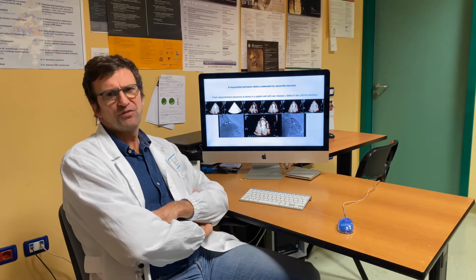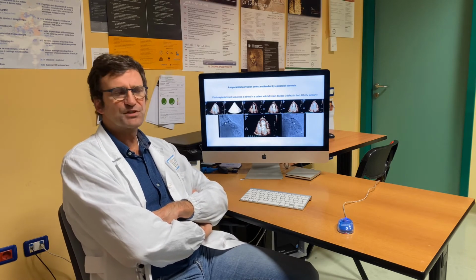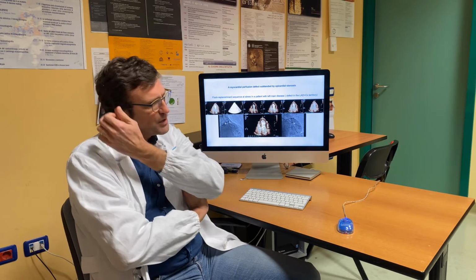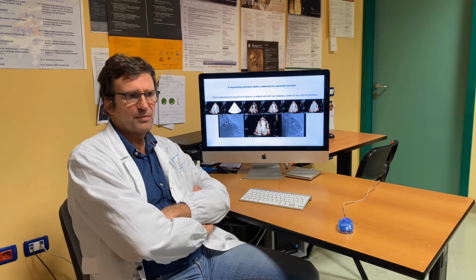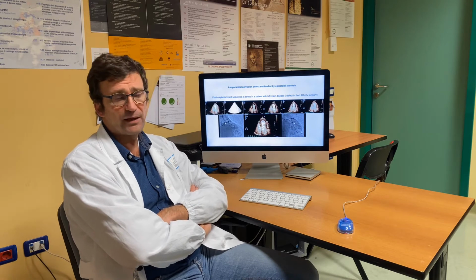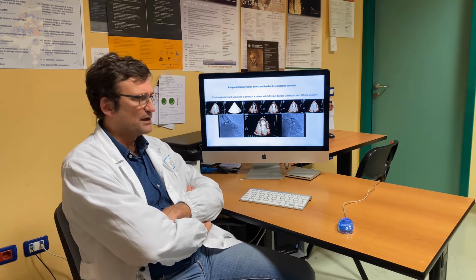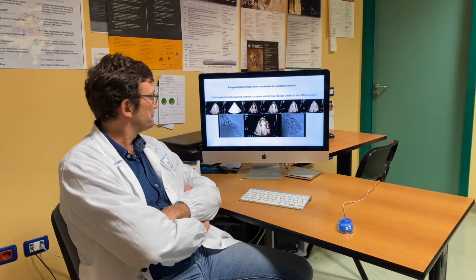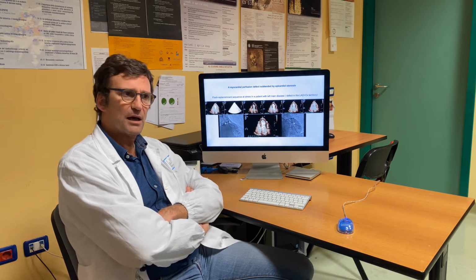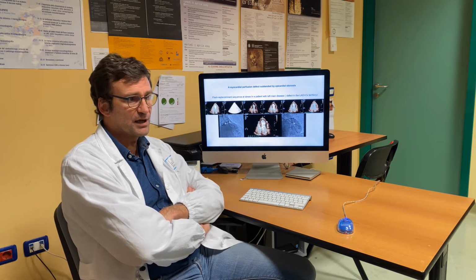Well, perfusion using echo, basically using ultrasound, has the advantage that echo has when compared to all other methods such as CMR or PET: it's so easy. It's bedside, it's portable, and very friendly to every clinician. This is the upside of perfusion using contrast echocardiography.